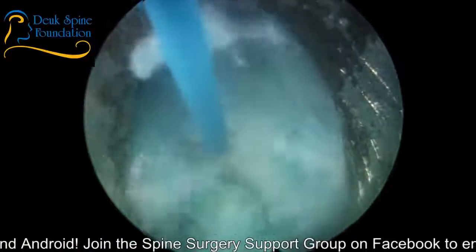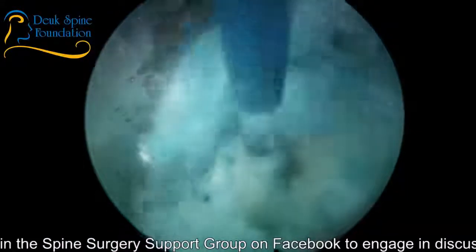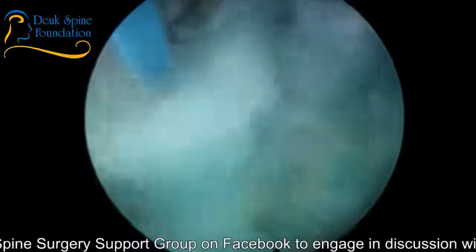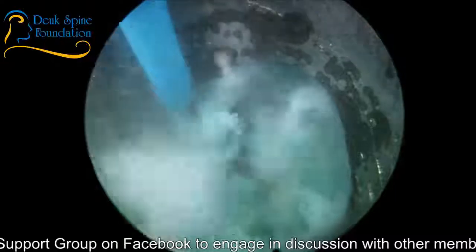So good observation, yes, indeed. The large tears will leak the dye out very quickly. You won't get much pressurization. You may not be able to elicit a response.